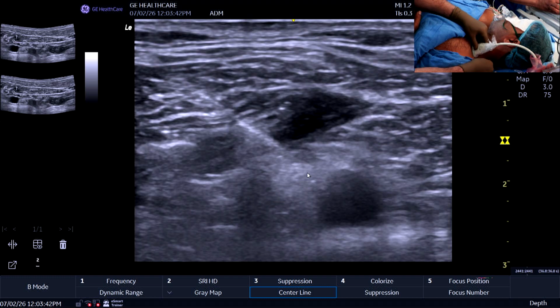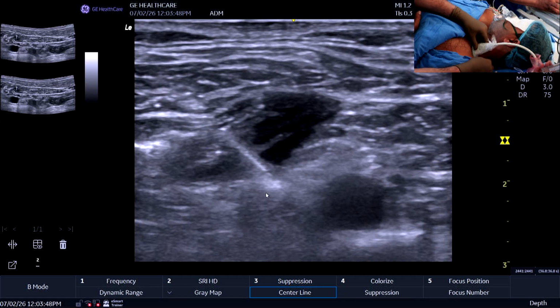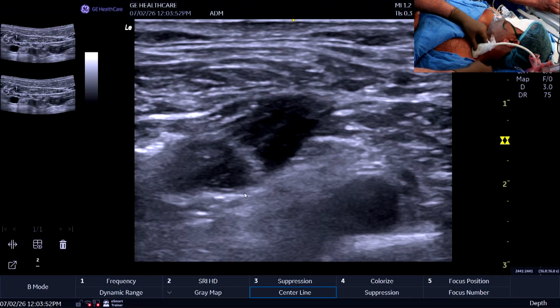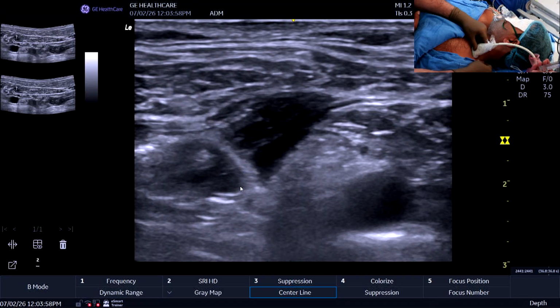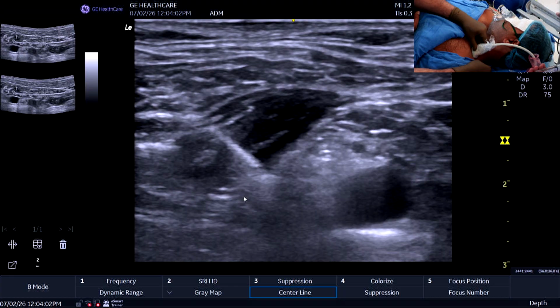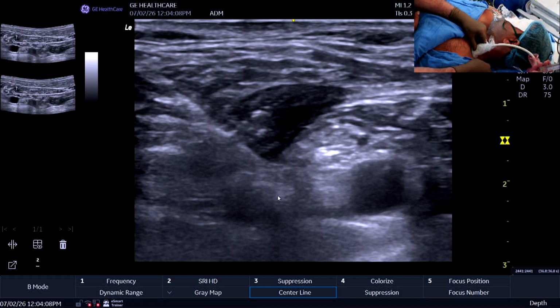Yeah, can you inject a small volume? So it is just going below the omohyoid. You can see the brachial plexus moving away. So this is a sort of extrafascial injection. It's not intrafascial. I have to pierce one more sheath here. As you can see, there's one more sheath between the suprascapular nerve here and the posterior divisions here. Towards the medial side, a small pop, and this would be intrafascial.